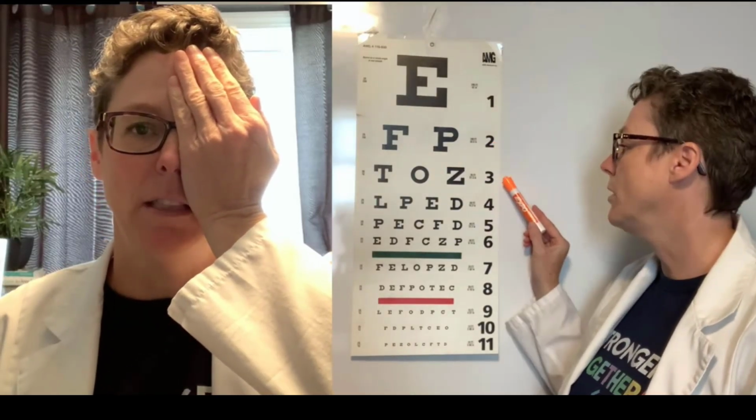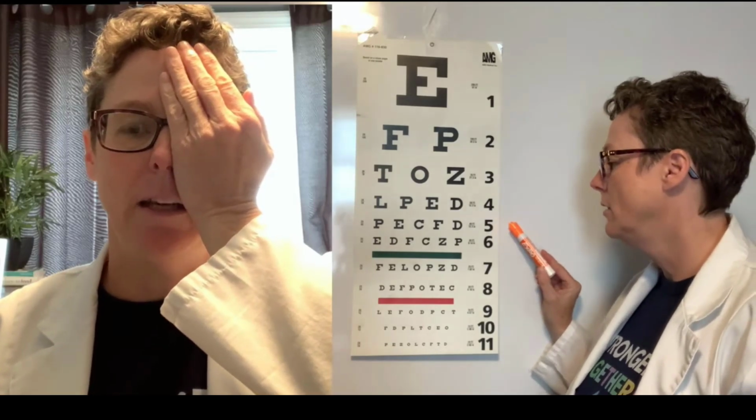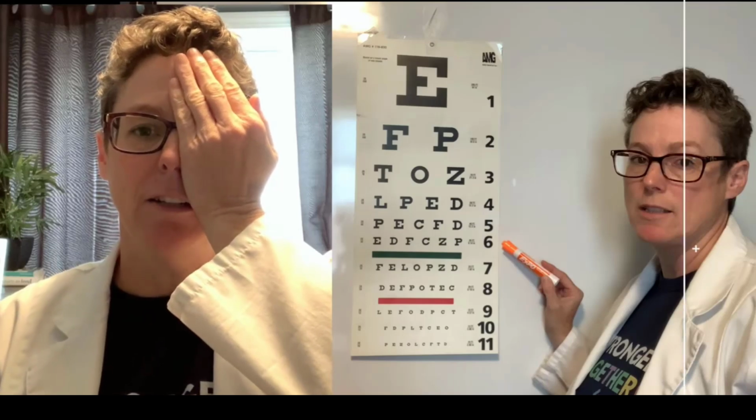Can you please read line 1? E, F, P, 3, T, O, Z, 4, L, P, E, D, 5, P, C, E, F, E, D, 6. And I can't read that last line at all.